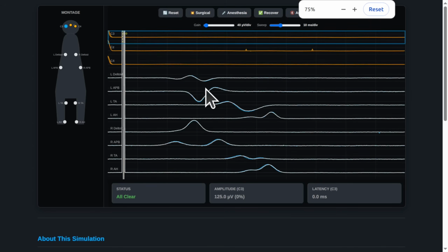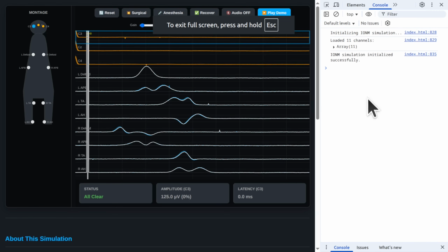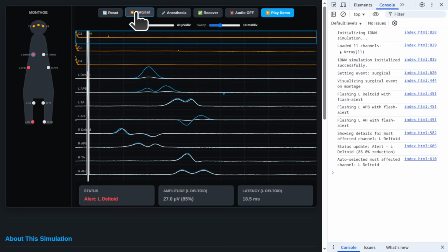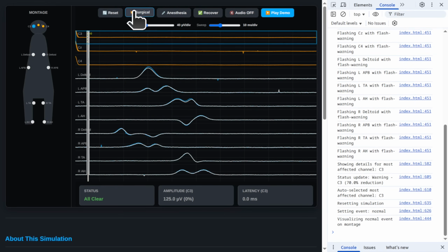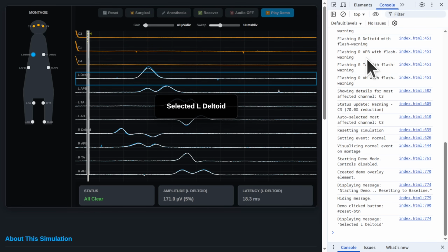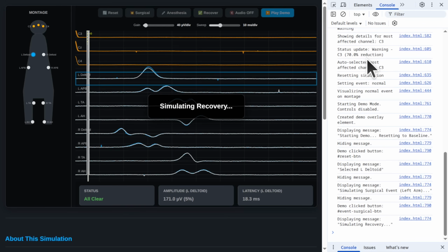We're going to explore how medical teams get that immediate, often life-saving knowledge, and we'll focus on a really remarkable tool, the IOM simulation web application. That's right. IOM, Intraoperative Neuromonitoring. Basically, it's like having constant vigilance over the patient's neurological function, their brain, spinal cord, nerves, all throughout the surgery. It's the ultimate real-time safety net.